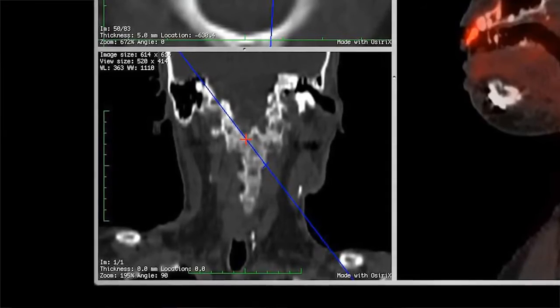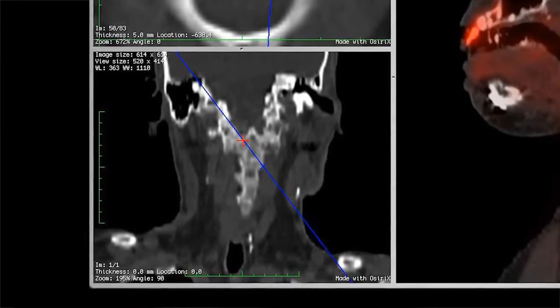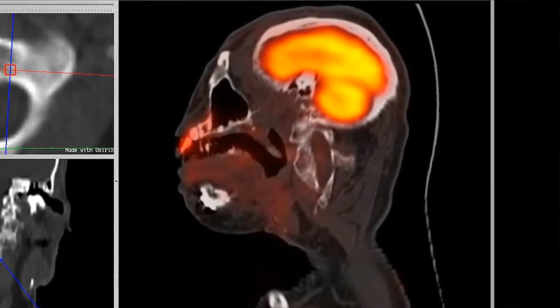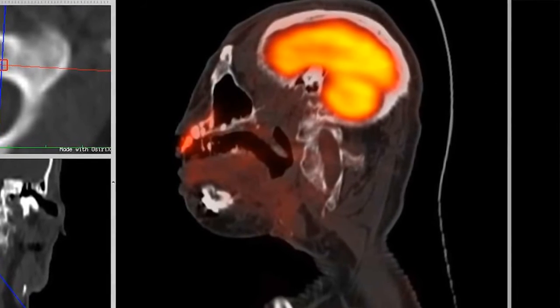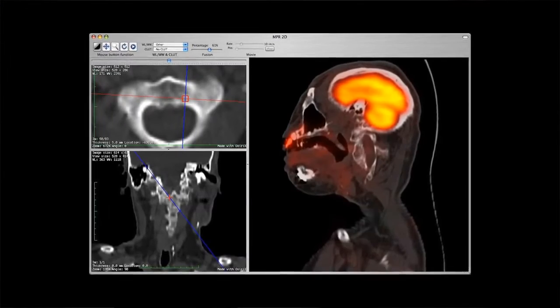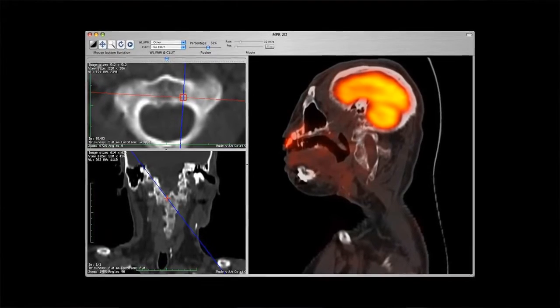So suddenly, that oddly shaped tumor that was very close to some organs we didn't want to hit, which was very, very difficult to get a good plan with on 3D, now becomes really easy, right? You suddenly come up with dose distributions that are vastly better than anything you got with 3D. And so in the last decade or so, most facilities are doing some form of IMRT for at least some of their patients.